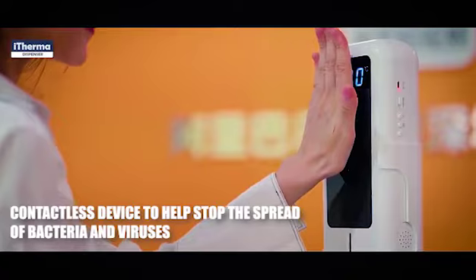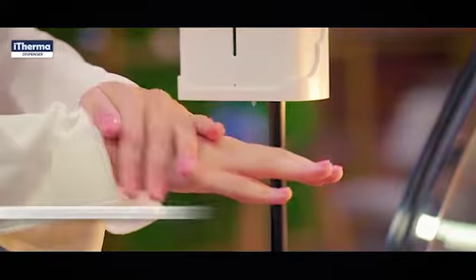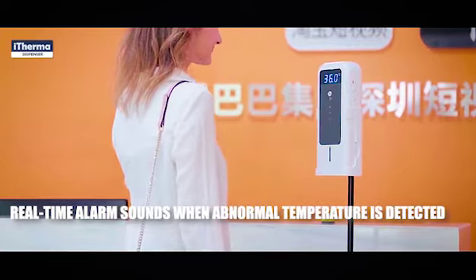Conveniently contactless to help prevent the spread of COVID-19 and other diseases. It includes an integrated automatic hand sanitiser dispenser, with body temperature readings announced and digitally displayed.